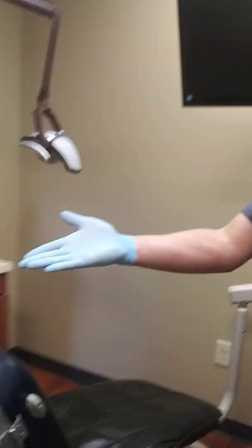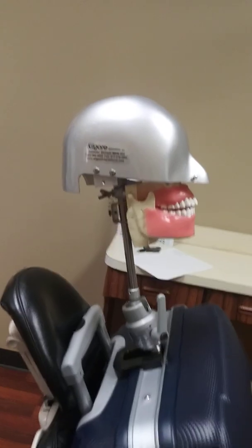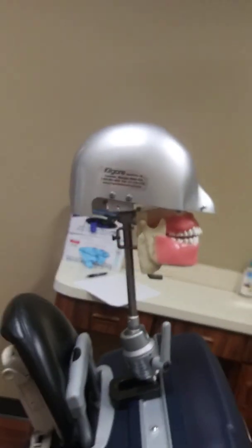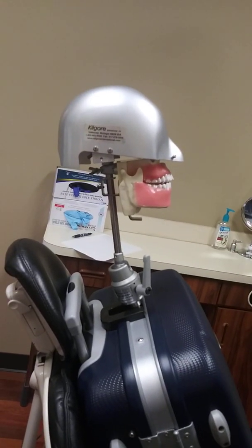The next thing we're going to do is have a willing patient who is going to be in the chair. Of course, we've already gone over medical history, already asked several different questions, and we've already done all of our radiation health and safety precautions by putting a lead apron over this patient.